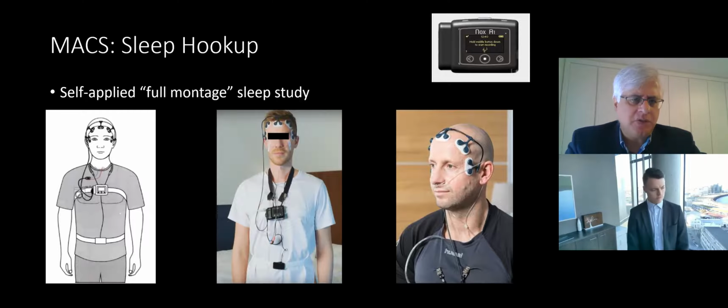We have developed over the years methodology so that individuals would have access to videos so they can watch and learn from a video. We actually have also mannequins in our clinical settings so patients who are coming in or research participants that are being enrolled can actually look at a mannequin and look at a configuration of this while they're visiting us.